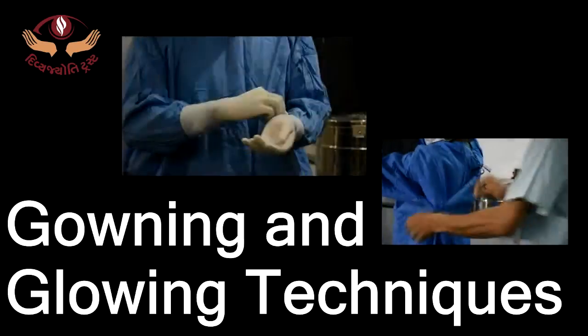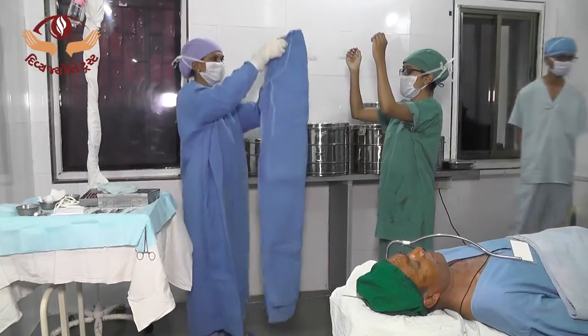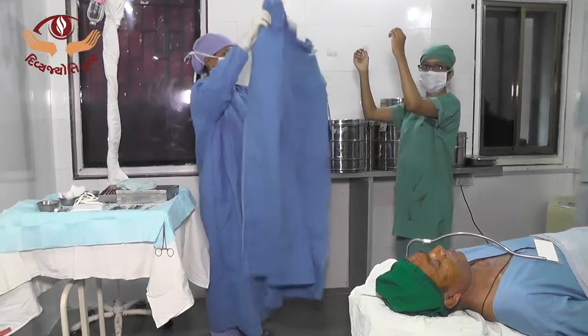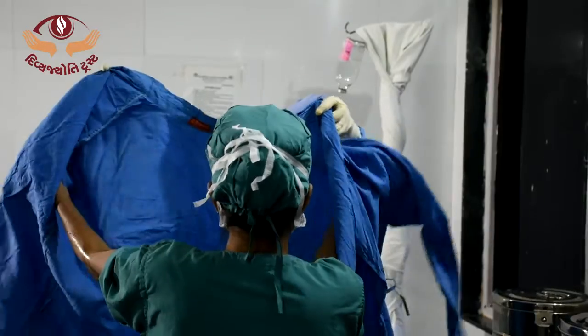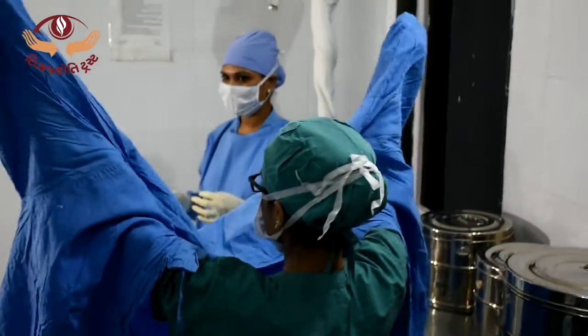Gowning and gloving technique. Gowning. Pick up the gown holding it well away from the trolley and your own body. Hold the neckband and unroll it until the sleeves are seen. Slide both hands and arms into the sleeves at the same time.